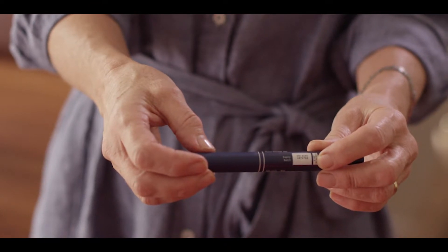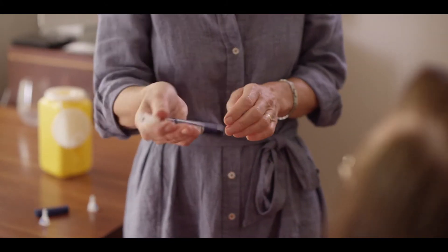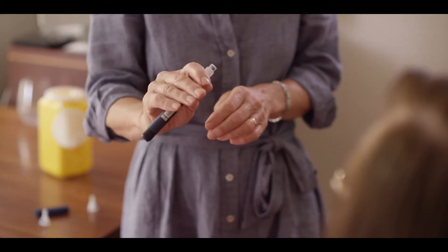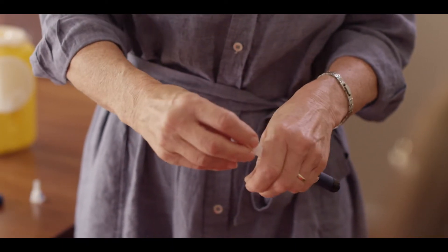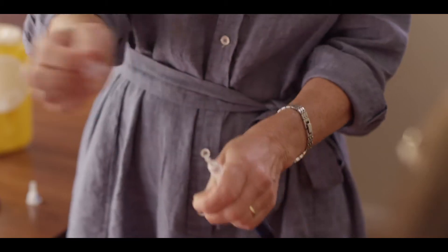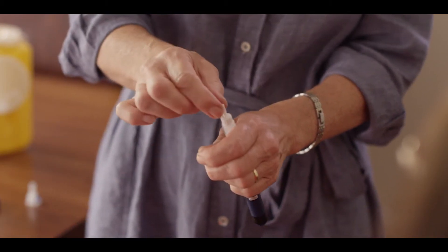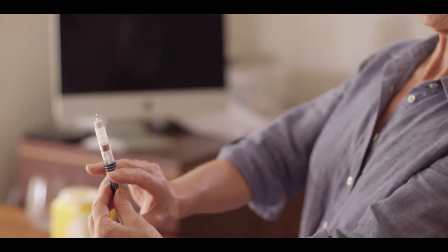Check the insulin looks right. If you're using an intermediate or mixed insulin that's meant to look cloudy, gently mix it before you inject. This should be injected 5 to 15 minutes before a meal. Apply a new needle each time, then prime it with two units and squirt it into the air to ensure it's working.